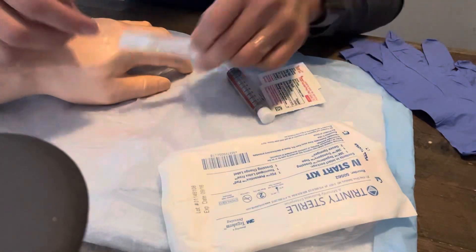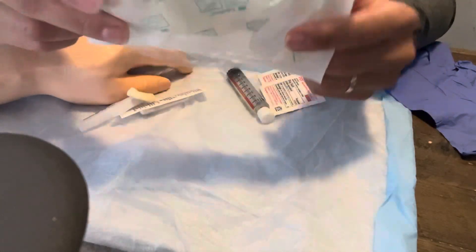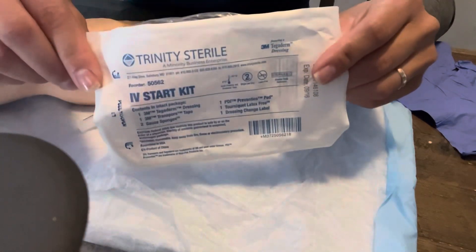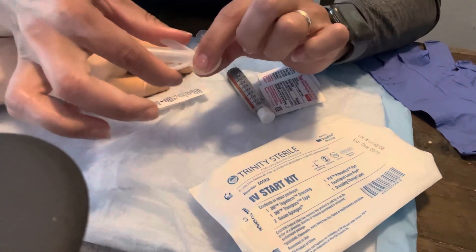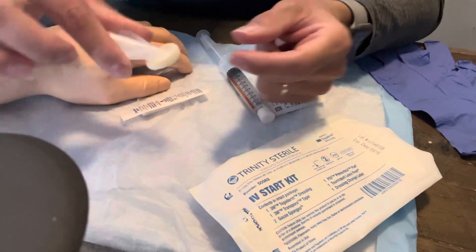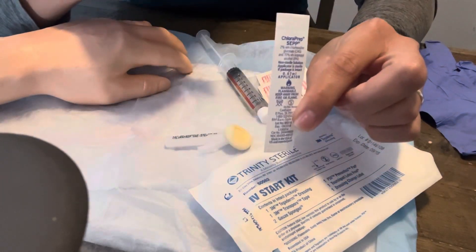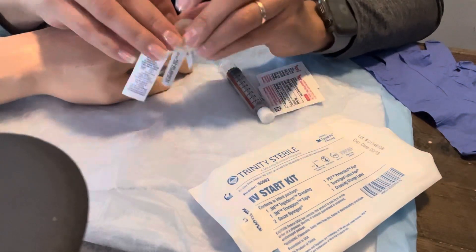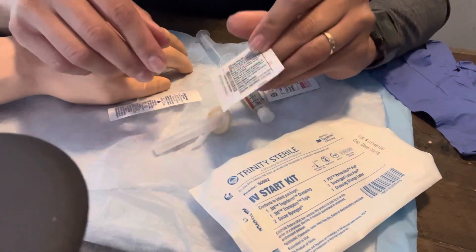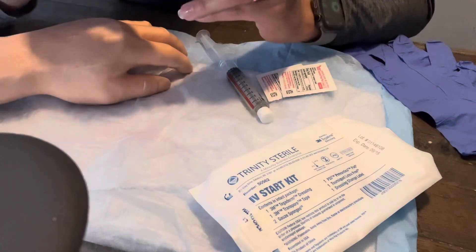I have different cleaning devices. Within the IV start kit there is a little chlorhexidine swab to clean the site. Some kits also come with little chlorhexidines where you break the wings, the solution comes out and you scrub. Some also come with little preps like this. You just want to make sure whatever site you go to insert is clean prior to insertion.